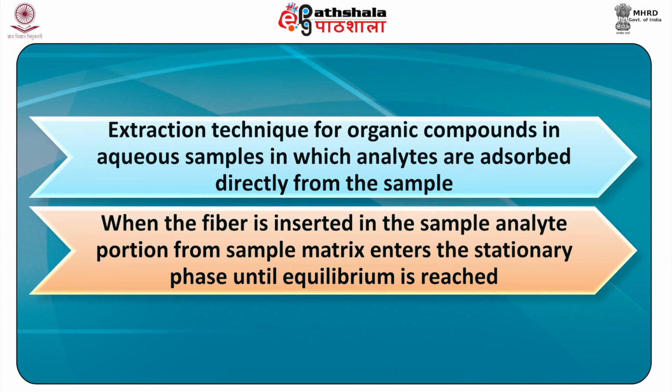until equilibrium is reached. The fiber is then inserted into the injection port of a gas chromatograph or GC, where it is heated and the analytes are rapidly desorbed thermally into a capillary GC column for the analysis.